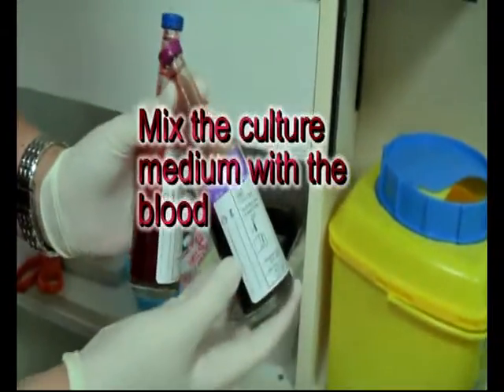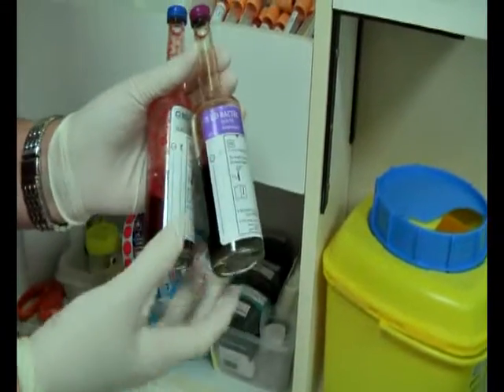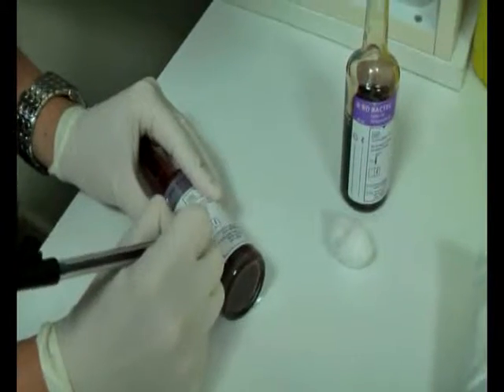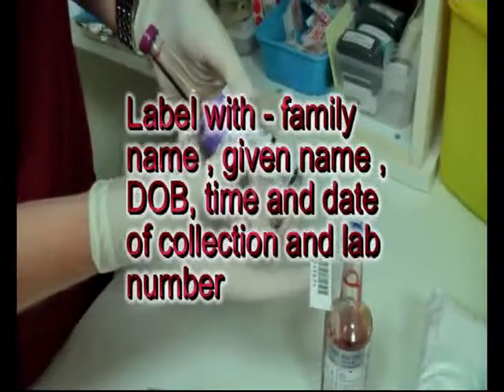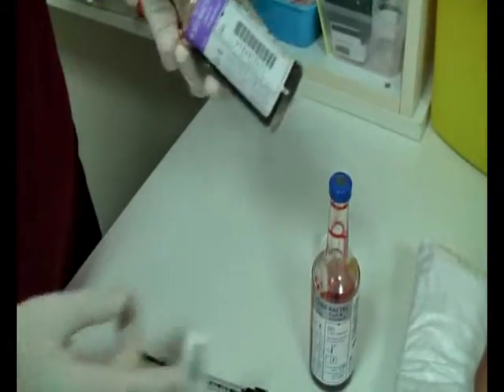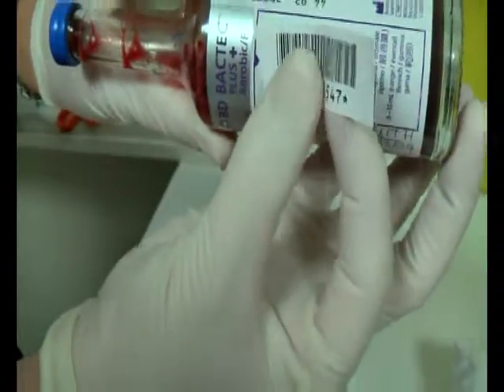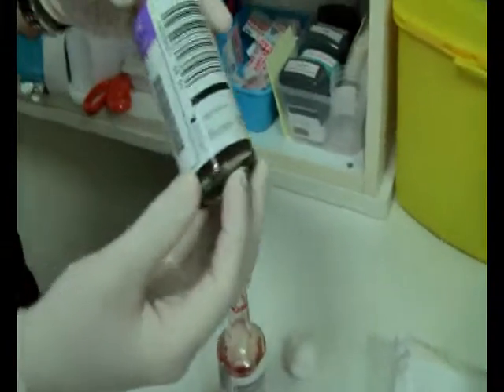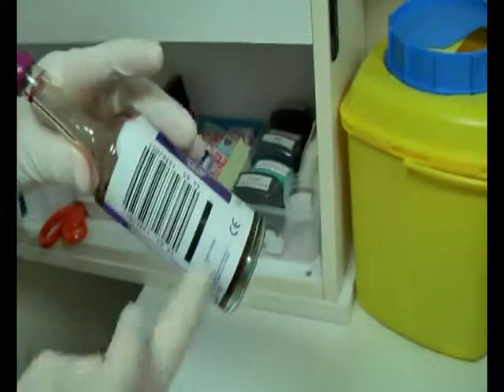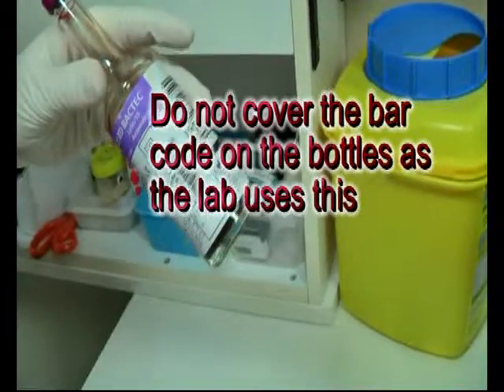Now label the jars with their essential points of identification, and time and date of collection is really important. When placing your lab number, it's really important not to cover the barcode that was already on the bottle. So just place it on a space where there is no barcode.